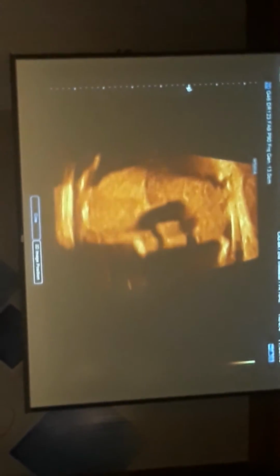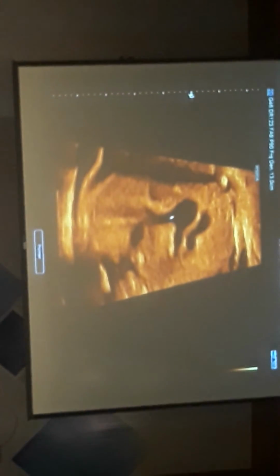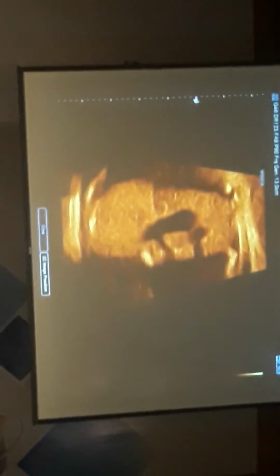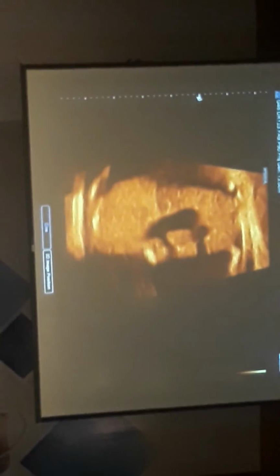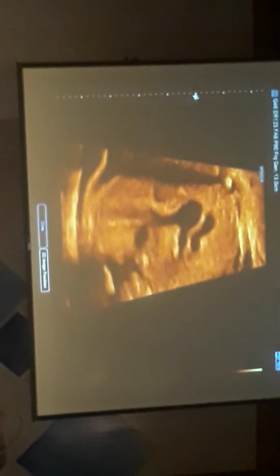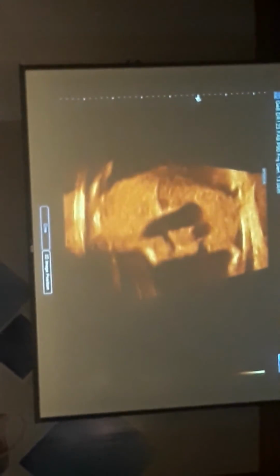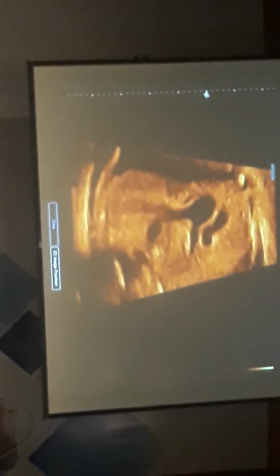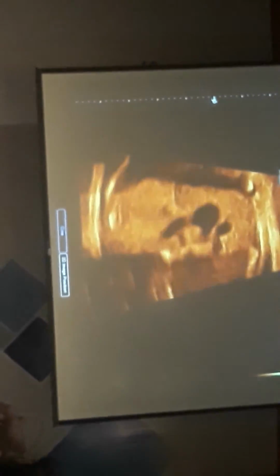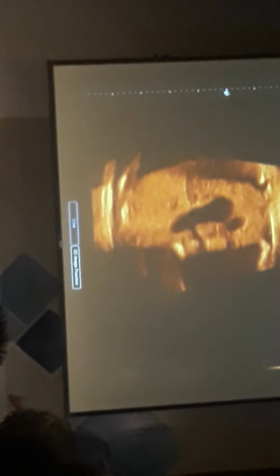See that? I just moved a little bit. Now we separate the left pulmonary artery, and we come up a little bit, and we have the ductus. But it takes different angles. There's the left pulmonary artery here. The ductus is there. So that's okay.